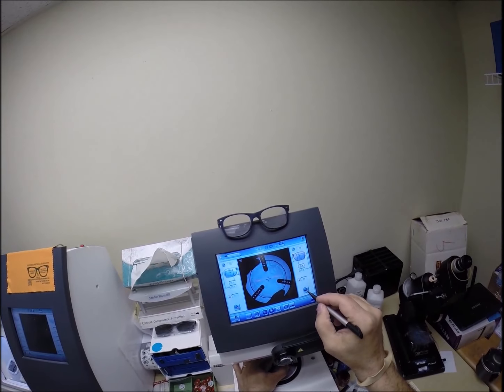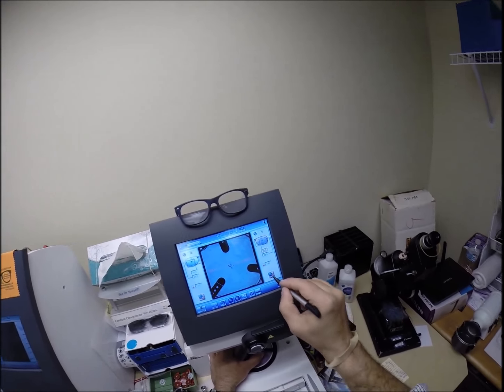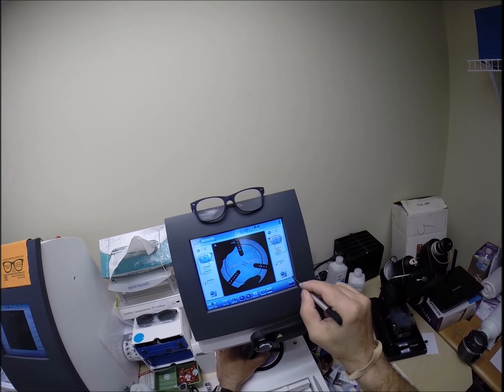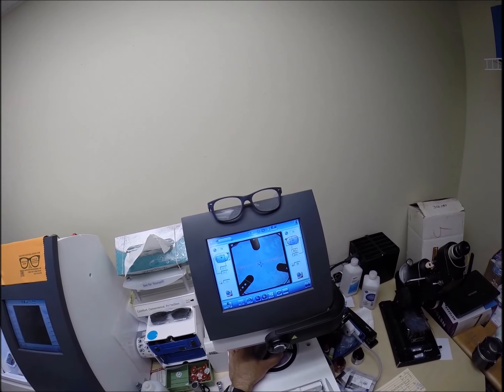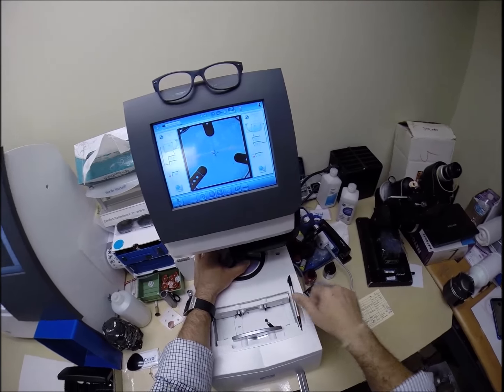Make sure the lens is large enough to fit. And it is. Get everything lined up perfectly. It barely fits. Barely, but that's good. That's a good thing. Hit the button. The arm comes down, places the block onto the left lens.